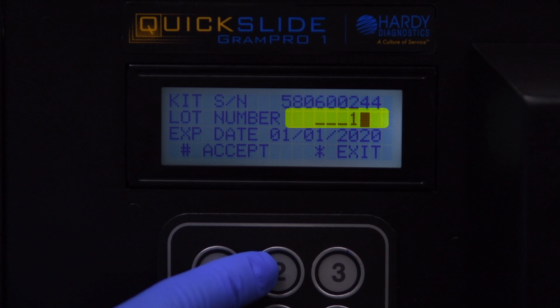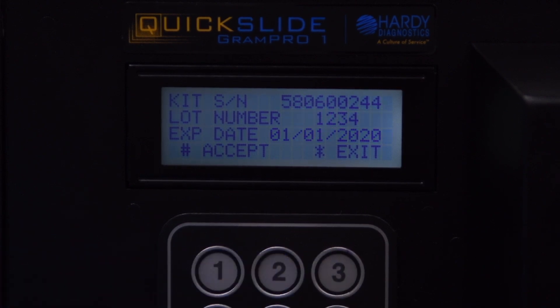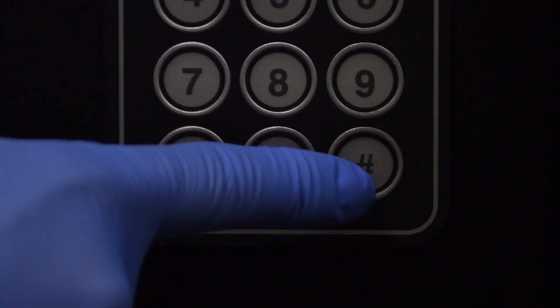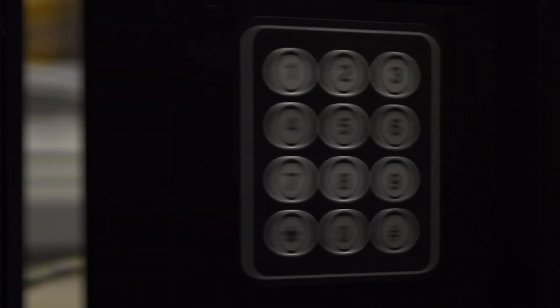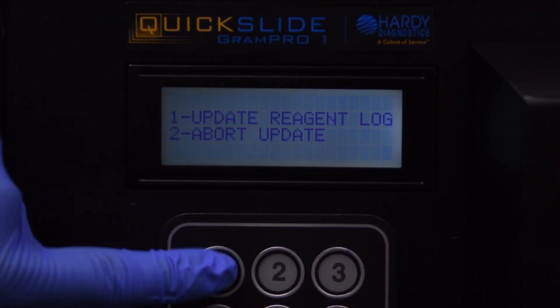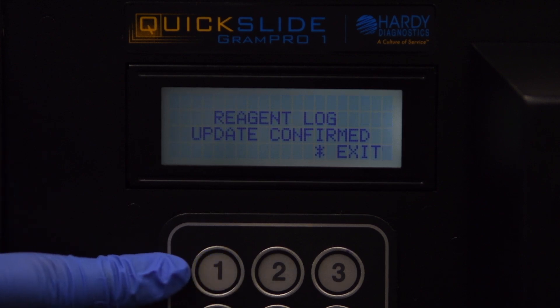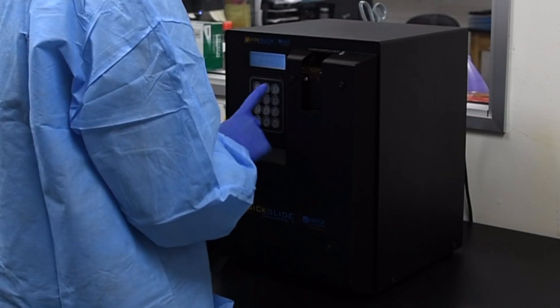Enter the lot number and expiration date into the appropriate fields as they read on the new reagent kit label. Press the pound key to select Accept and save the kit registration information. Press the star key to exit, then press 1 to update the reagent log and activate the kit. The Gram Pro 1 is now ready to operate.